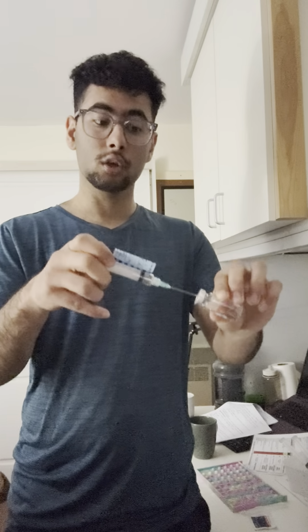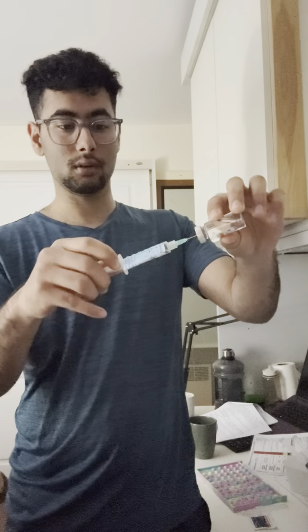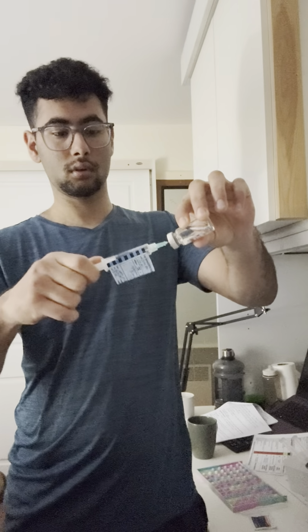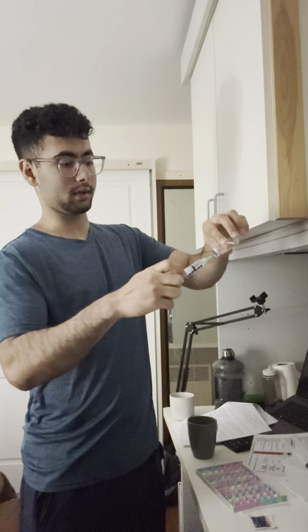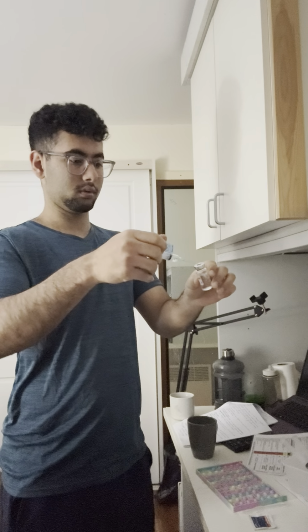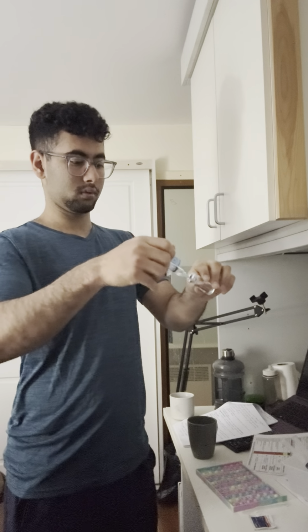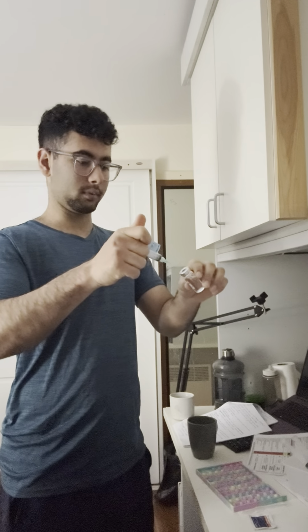Now you're going to draw it up, because you drew 10 ml, so you're going to draw 10 ml as well. You know how to draw properly. You can do it like taking out and doing like that as well if you want. It might be hard for some people, but I think over time you will get over it.